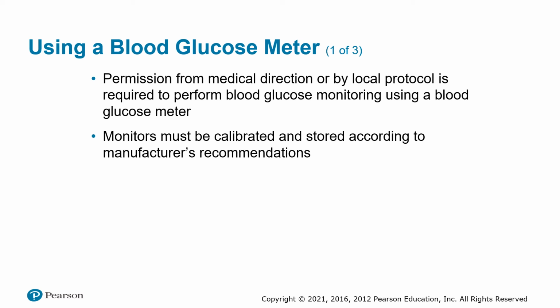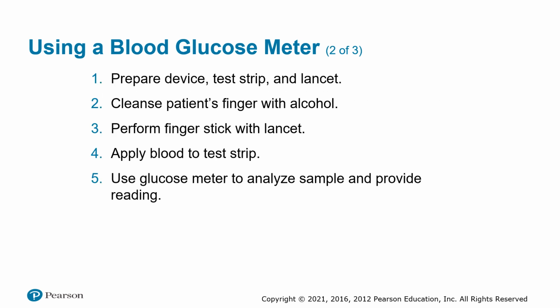You have to have permission from your medical direction or local protocol to perform blood glucose monitoring using a blood glucose meter. The state of Missouri says that you guys can obtain and treat patients with a glucose meter. So you guys can do that. Monitors must be calibrated and stored according to manufacturer's recommendations.